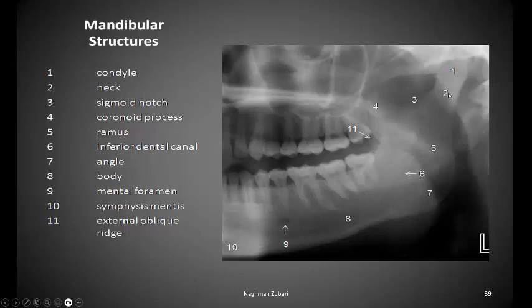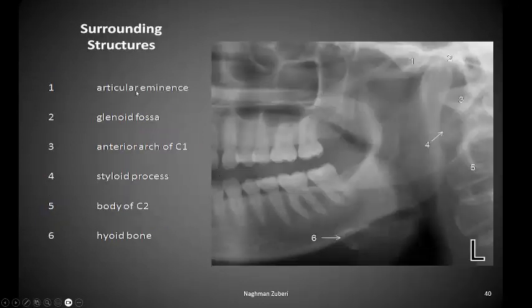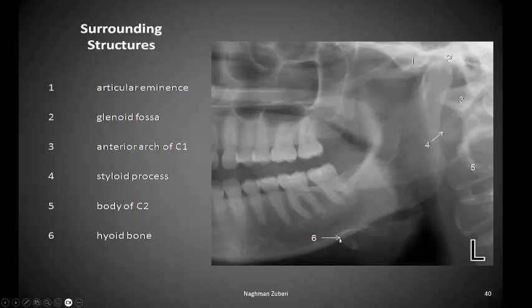On the radiograph we can identify: the condyle, neck of condyle, sigmoid notch, coronoid process, ramus, inferior alveolar canal, angle of the mandible, body of the mandible, mental foramen, symphysis menti, external oblique ridge, and internal oblique ridge. Surrounding structures include the articular eminence, glenoid fossa, anterior arch of the first cervical vertebra, styloid process, body of the second cervical vertebra, and hyoid bone.